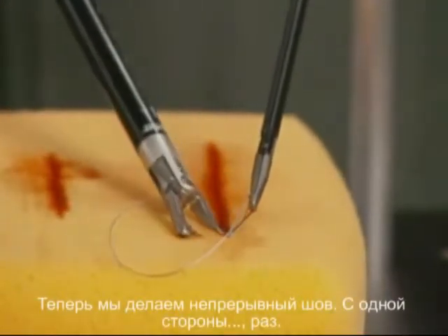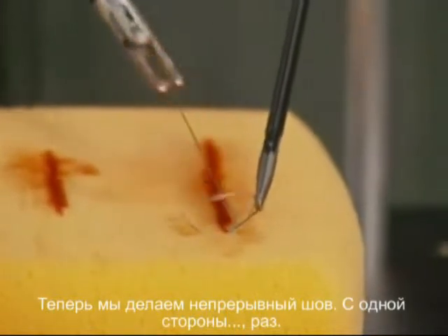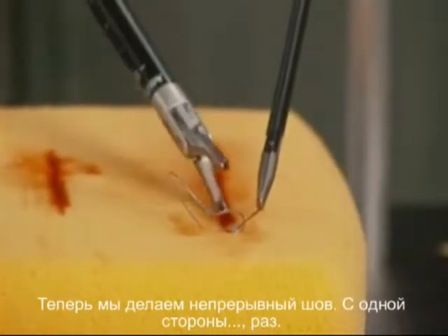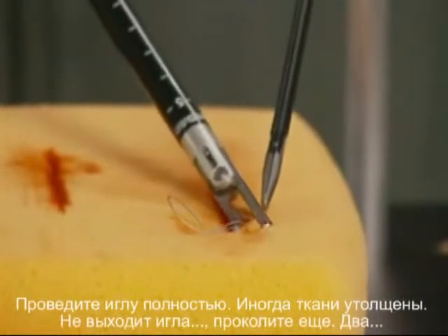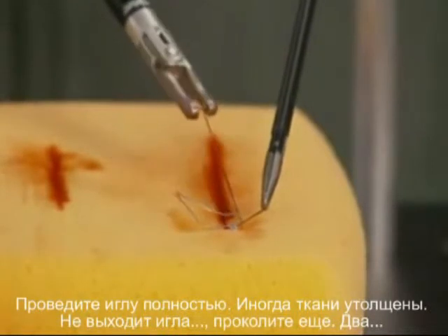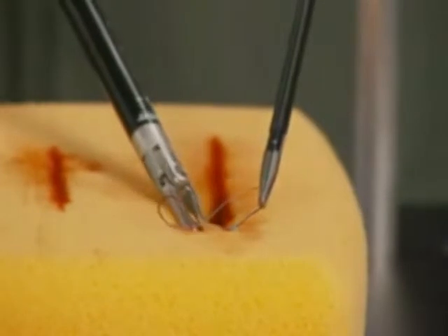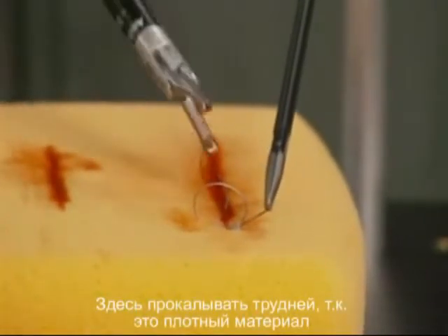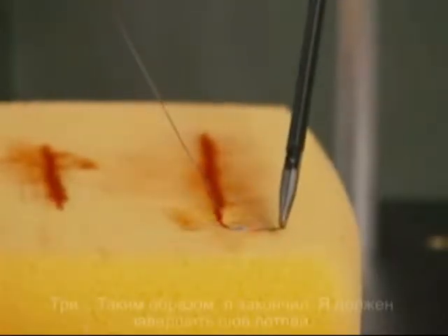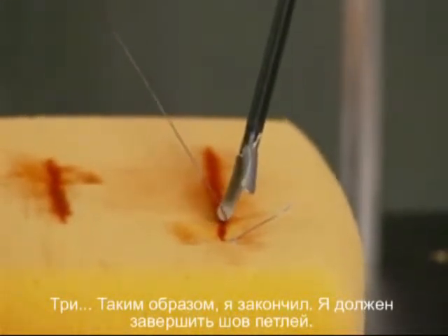Now I'm going to do the running stitch — got the needle on each side. You're going to push the needle all the way through. Sometimes with thick tissue, if it gets caught up, just do it again. You have to squeeze real hard on thick tissue. Now there's a variety of ways to finish.